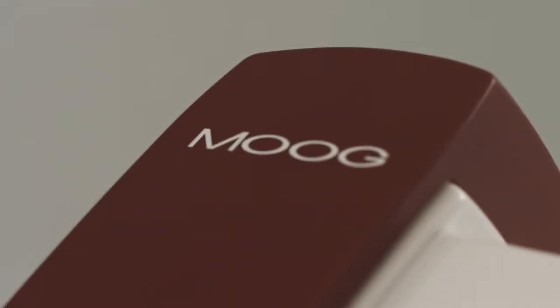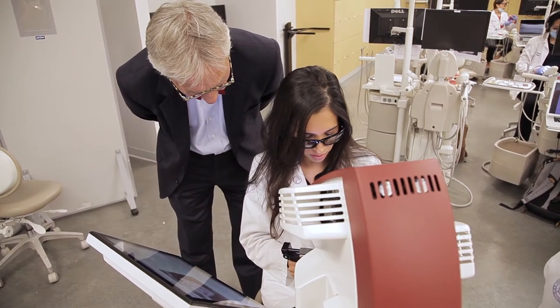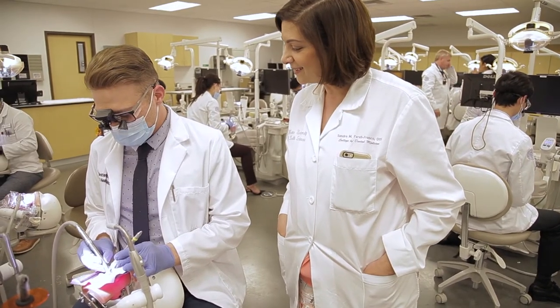This is not so much a replacement of the phantom head but a very critical adjunct to the training of the student. Really just having the technology here allows you to practice a whole bunch of times before you sit down with a mannequin and a white plastic tooth and actually do the cutting.